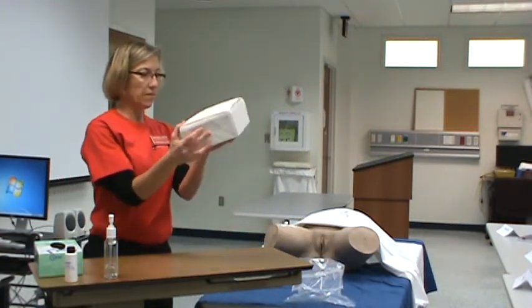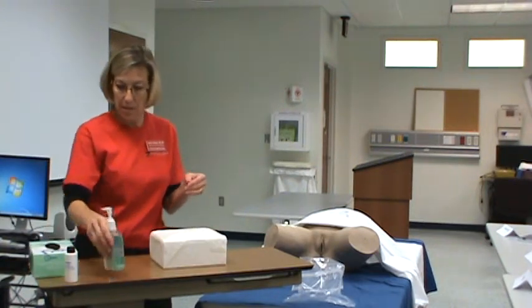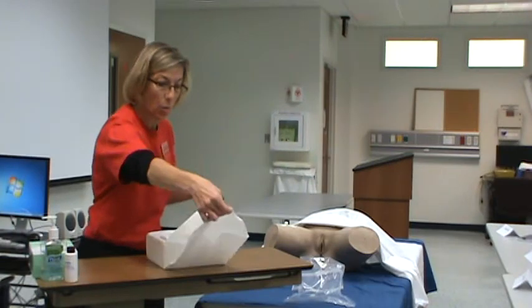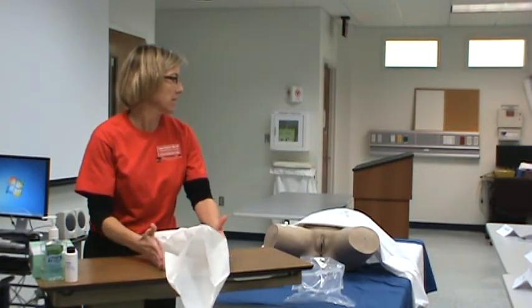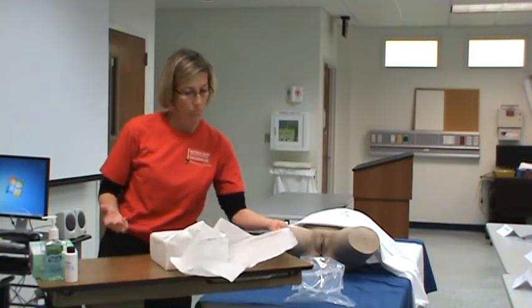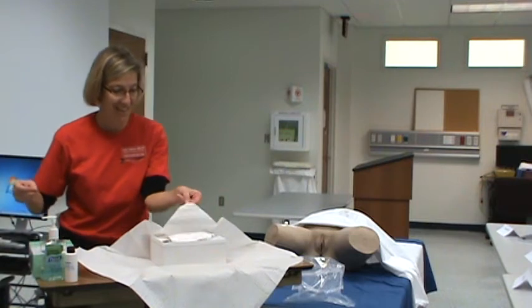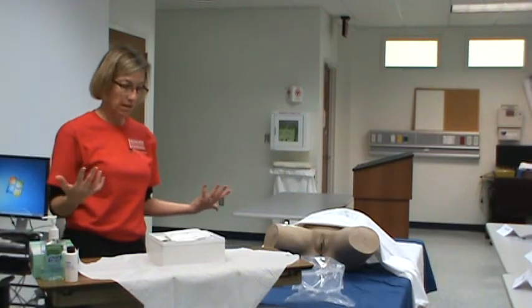So again, all of these are different, but you want to open it sterilely, or sterile-esque. And this one's got it going this way, so I'll go away from me. Because I can touch this, right? This isn't sterile, because this is the outside. I always hate that. It always scares me.